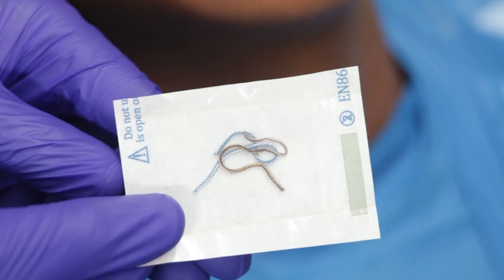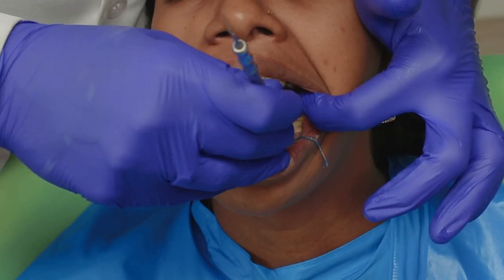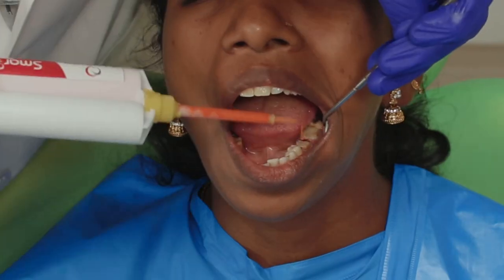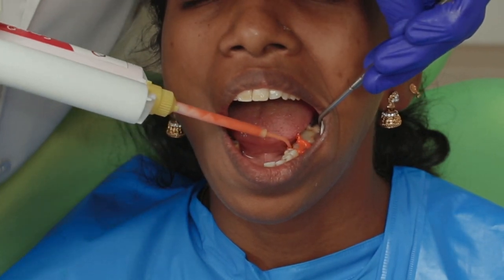As usual I have placed two retraction cords here. One of them is a double zero cord and the top cord is a number one cord. While my assistant loads the heavy body on the tray, I will get the top cord out and express some light body into the sulcus and also along the occlusal surfaces of the teeth.